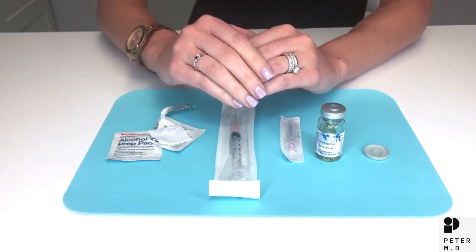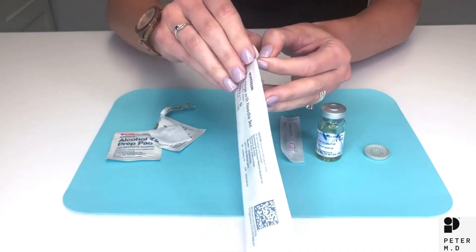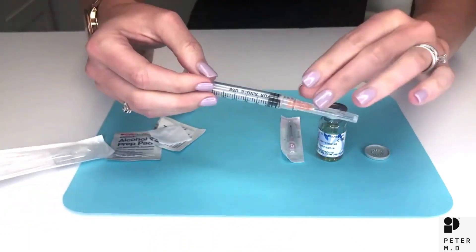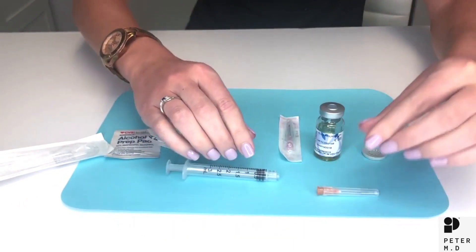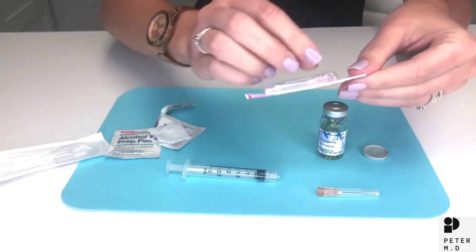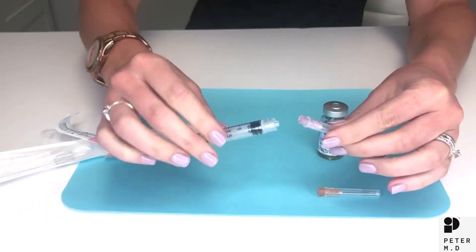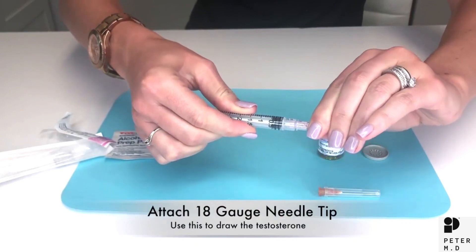Next we are going to change out the needle. Unwrap the syringe and twist off the 25 gauge needle that comes attached. Set this aside. Now take the 18 gauge needle, unwrap it, and attach it to the syringe by twisting until it clicks or kind of squeals.